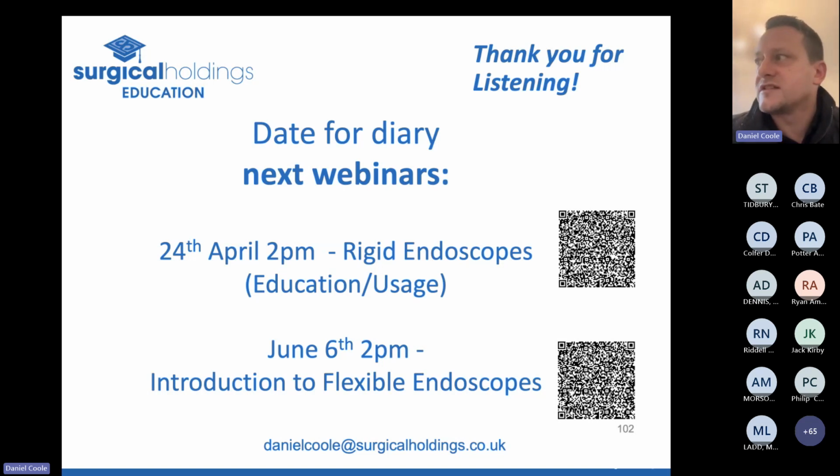Remanufacturing is something that's interesting, and I'm seeing that come up a lot, particularly for some single-use devices. That is taking the device away, and that company would be accredited to manufacture that device and would remanufacture it and put it back under a CE mark or a UK CE mark back on the market. That is quite interesting. I think that's possibly something that could happen.